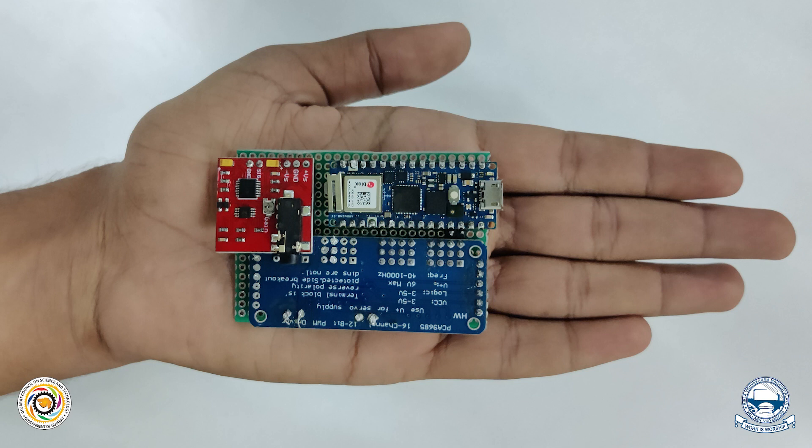Arduino Nano RP2040 Connect is used for high computation power, WiFi capability, greater storage capacity, and fitting into the concise space available to reduce a bulky outlook.